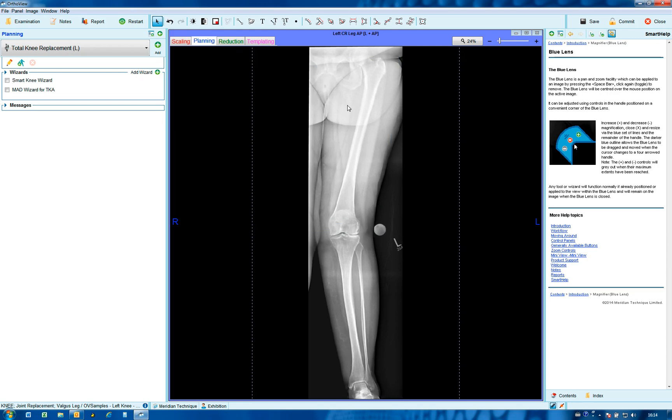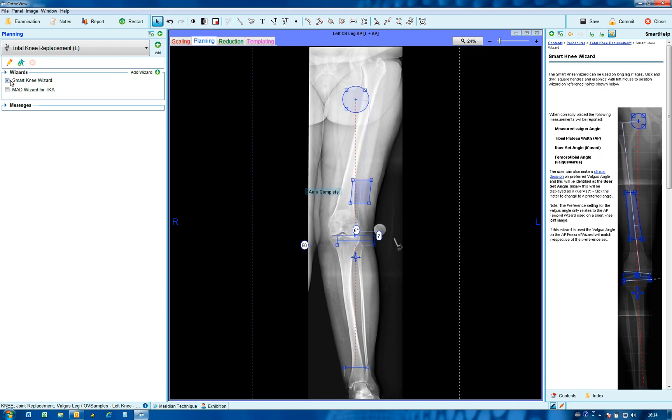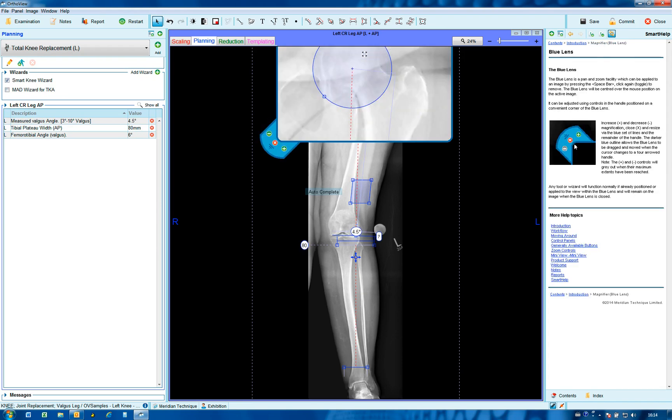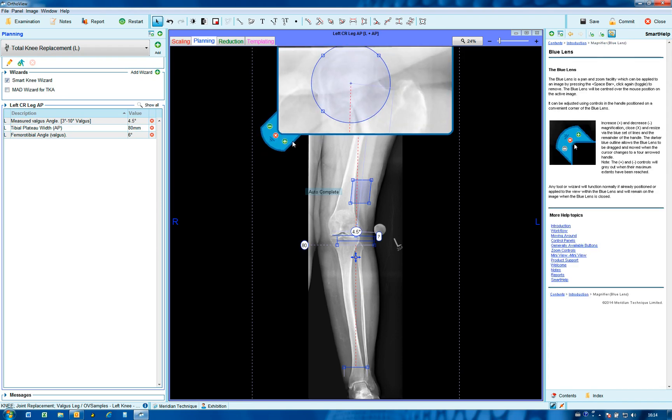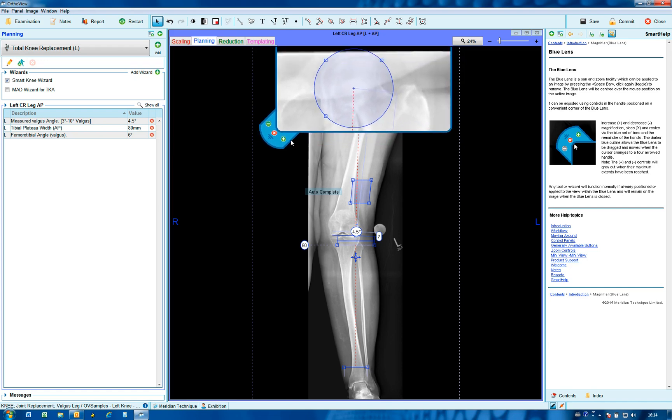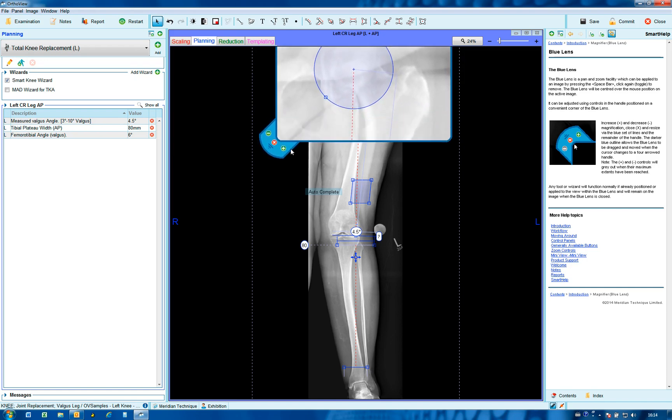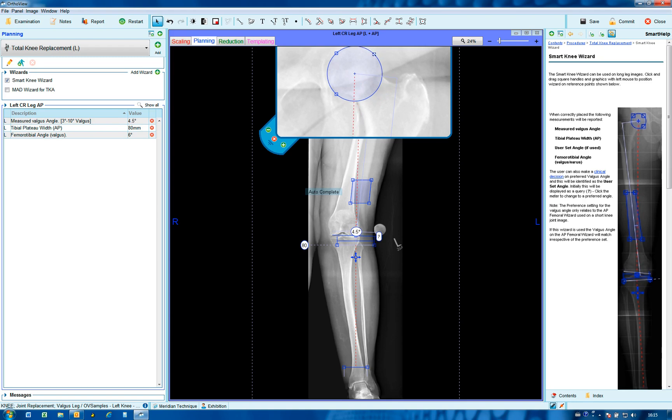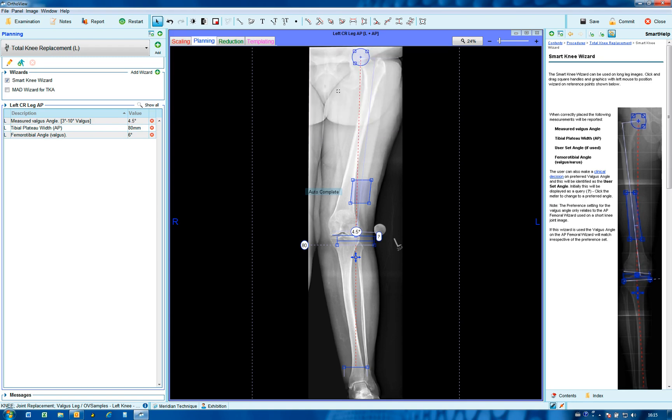For easy use, for example in positioning the smart knee wizard, it's best to move roughly to position, click on the space bar, make your exact positioning by dragging anywhere on the edge of the magnifier to see the edges, and then adjust accordingly. When finished, it makes sense to turn it off and move to another area of interest rather than trying to drag it to that area.